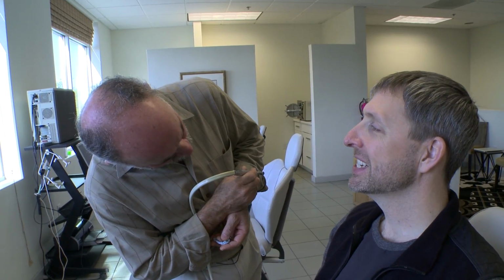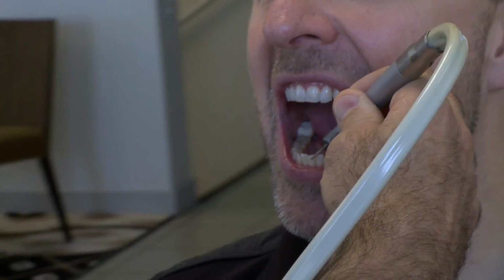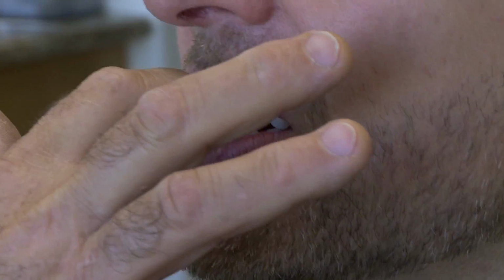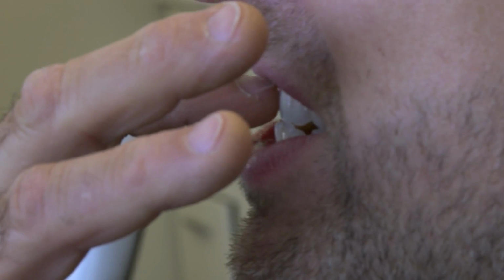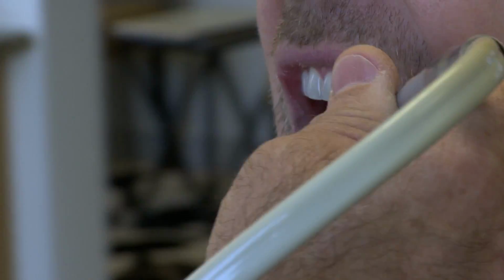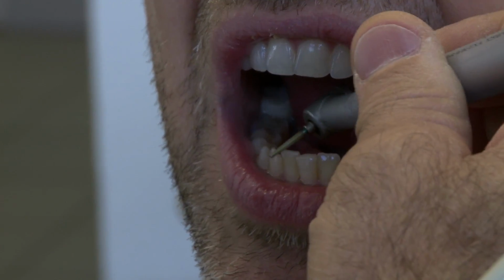Bite, stay closed. Open. Stuck. Talking about thousandths of an inch here. Tap, tap, tap again. What a difference, wow. Yeah. The right side's too strong now. Stay closed. Open again. Yeah, hitting front teeth, there's like 6 times as many sensors in front teeth as there are in back teeth.